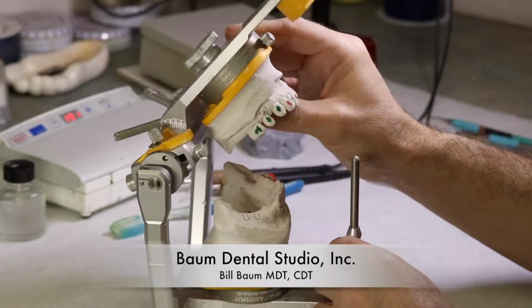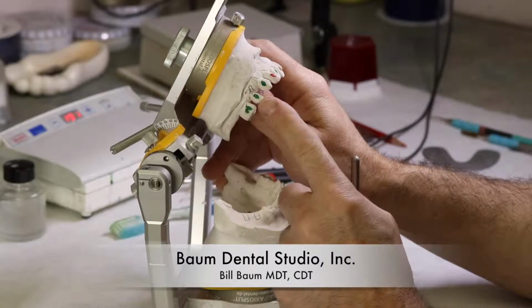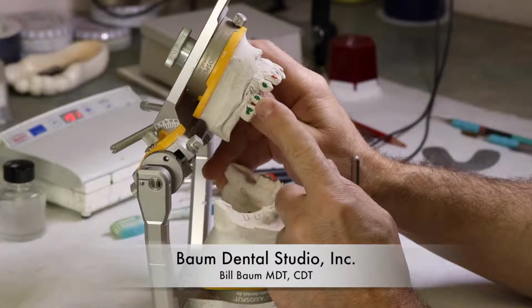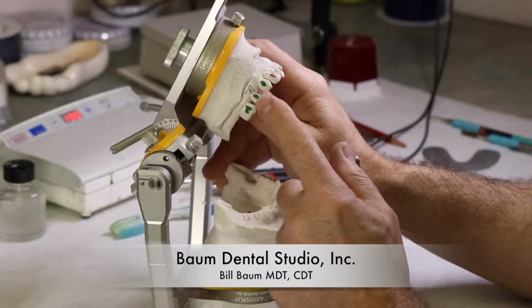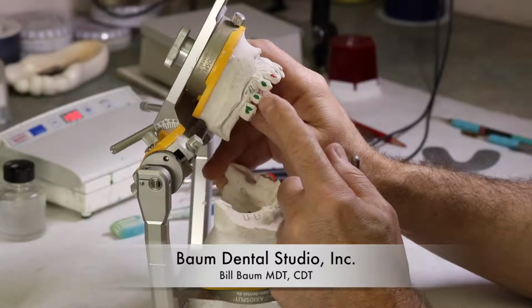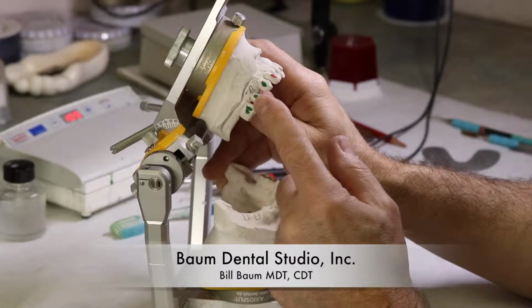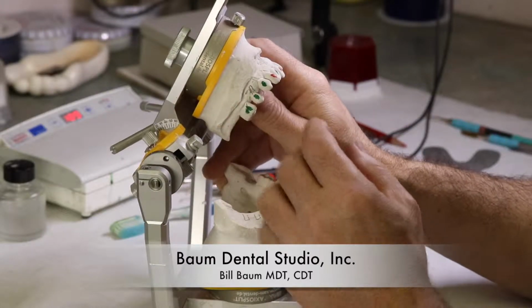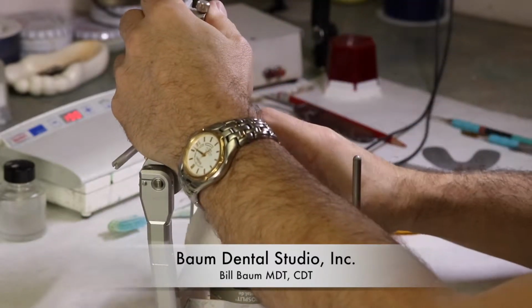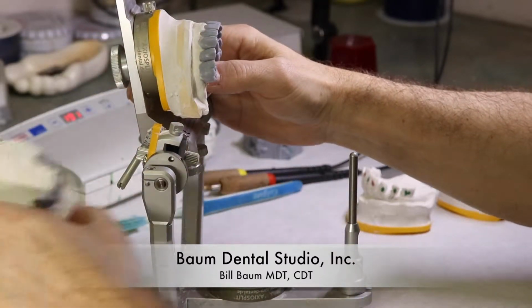One of the challenges that we have is this tooth. And this is a nice, strong, healthy tooth, but it's not in an ideal position. So as you'll see when I show the wax up, I did the best I could to arrange these teeth so as to get this tooth incorporated into a supporting abutment without making things too wide. Put this on the side, and my wax up is just about complete.